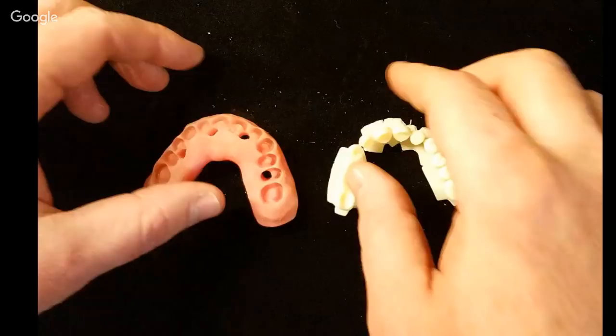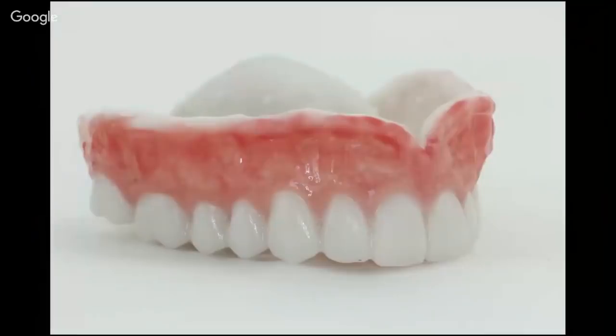You could just add on the gingival composite. Again, I told you that other case was the very first case I ever did with gingival composite. This is the second. Again, I'm no master with this stuff, but I think it's a decent result. And with any amount of practice, I think we could get where this is predictable to have a super nice result. And so imagine charging, who knows, $300-400 for this, and it's your economy denture.